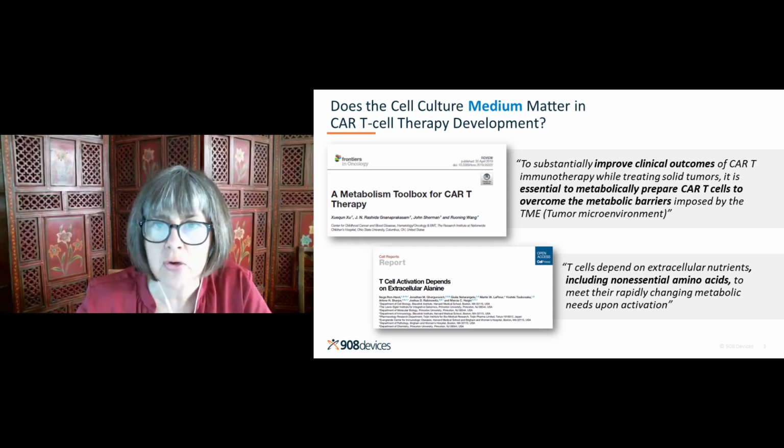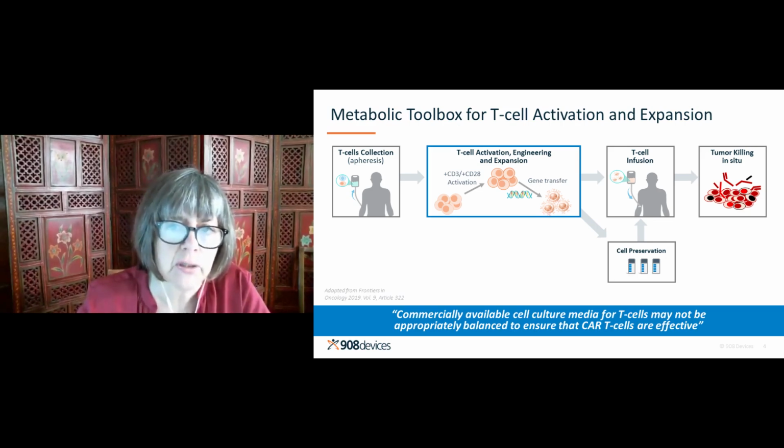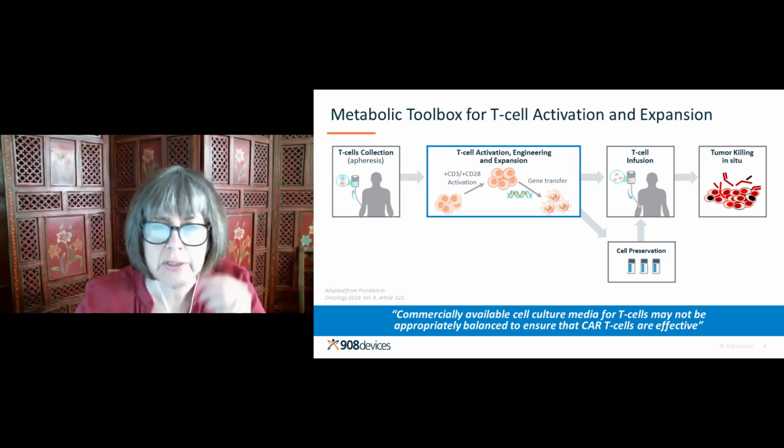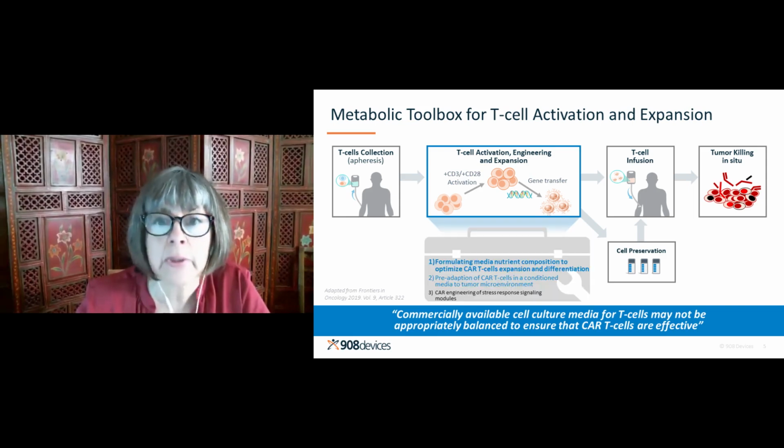So yes, cell culture medium matters, and we have to optimize it, and we have to have ways to look at it. So if we focus on the T cell activation, the ex vivo portion of CAR T cell manufacturing, we can find tools to metabolically prepare these cells and activate them.